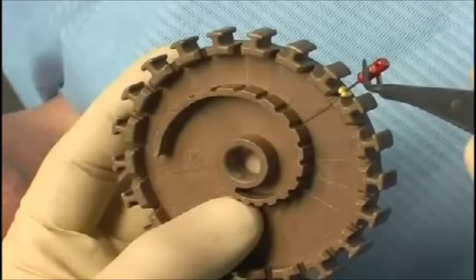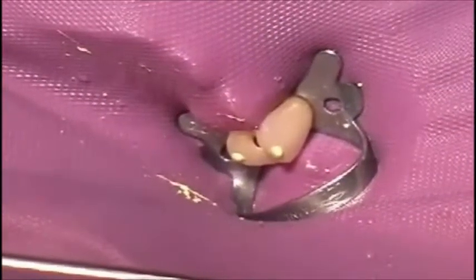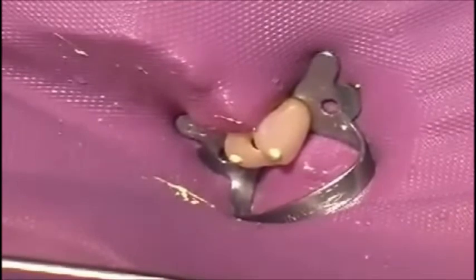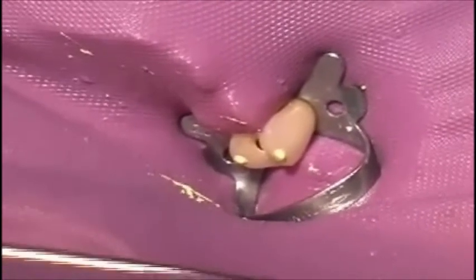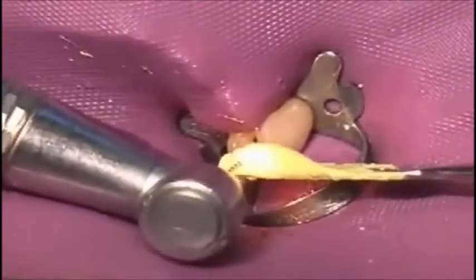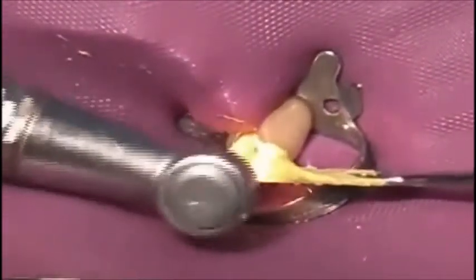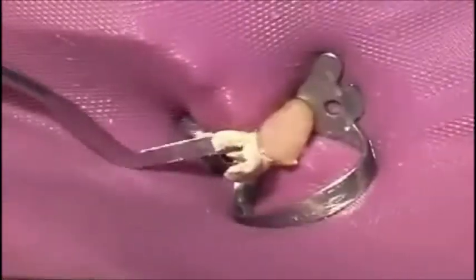If the tooth has a strong foul odor, if pain is experienced, or if there is severe bleeding from the interior of the tooth, then a final filling of the tooth's interior should not be done. In such cases, a medication, the yellow paste seen here, is rotated into the tooth, which is then tightly sealed for a couple of days.